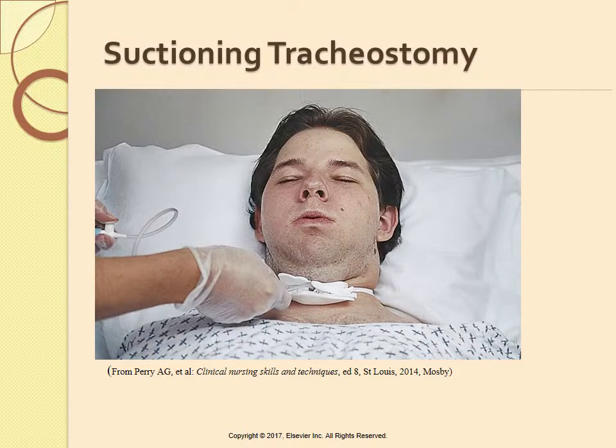Okay, so when we suction a trach, assess the need for suctioning every 2 hours. Indications include coarse crackles or rhonchi over large airways, moist cough, increase in peak inspiratory pressure on a mechanical ventilator, restlessness or agitation if accompanied by a decrease in the SpO2 level. Do not suction routinely or if a patient is able to clear their secretions with a cough.